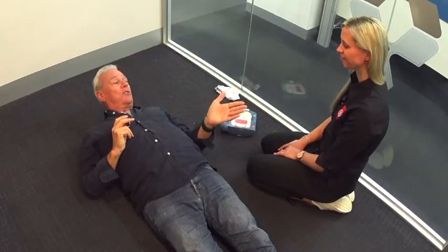So here I am folks. I'm on the floor for a very good reason because Katie, who's a senior trainer from St John Ambulance, is going to demonstrate how one of these wonderful defibrillators actually works. It just might save somebody you like or love if they have a heart attack and need it. So Katie, I'm going to pretend I'm unconscious.